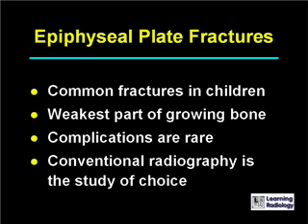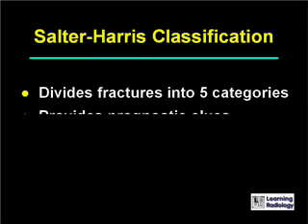Epiphyseal plate fractures are relatively common fractures in children. They occur through the weakest part of the growing bone, the epiphyseal plate. Most heal without any problems, complications are rare, and conventional radiography is the study of choice.